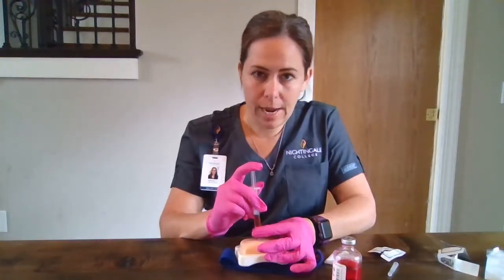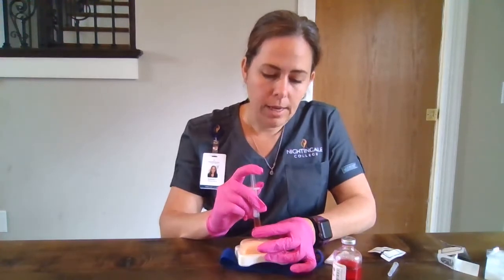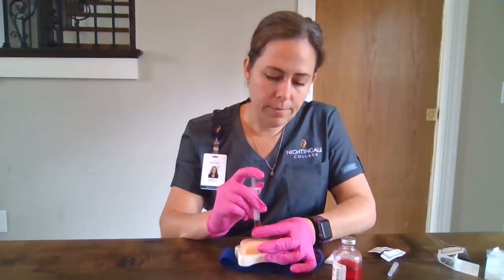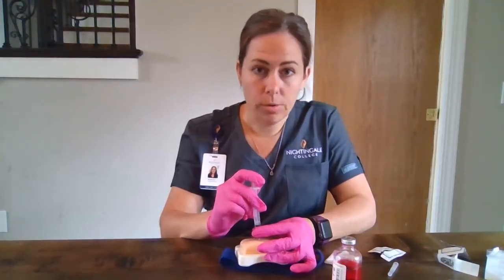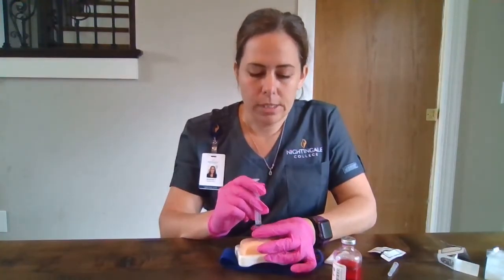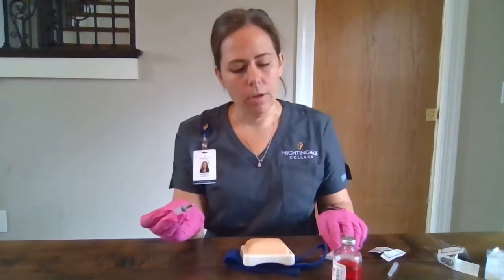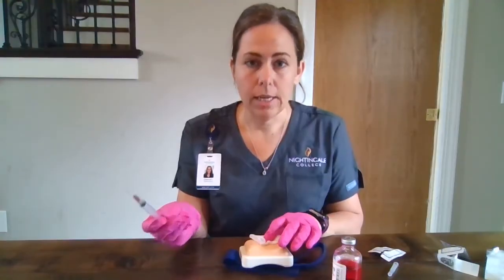For this one, we're going to aim for about 10 seconds per ml and inject that slowly. After we inject it, we are going to hold it for about 10 seconds before we withdraw our needle, and then we will release our traction and withdraw our needle. We're going to place our gauze, put a little bit of pressure, but make sure we're not rubbing that site.